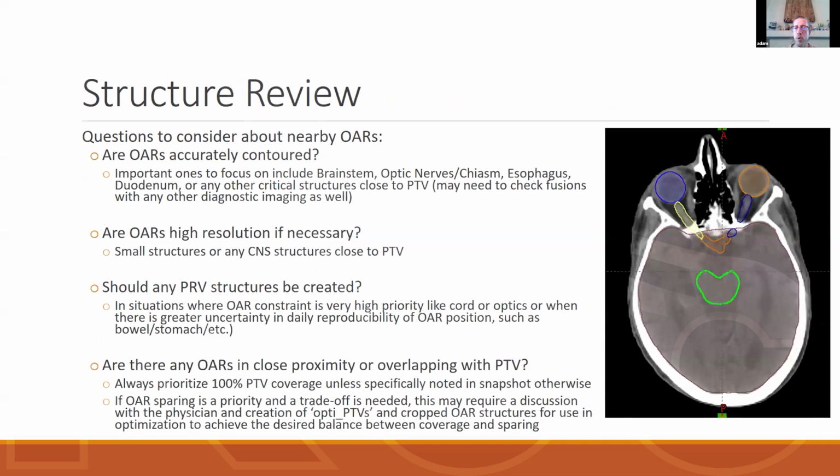And so something really important, some hospitals utilize it a lot, some not as much. But imaging, if you think about it, like Brendan said, it's what we use to actually contour, and the contours are what are used for planning. It's also what we use to treat the patient. And so looking at all of your imaging and seeing what's important in terms of organ at risk motion, movement, are there preferable phases? If there's a 4D, are the fusions accurate? Are the fusions appropriate, right? So you wouldn't want to fuse, say, something that's moving in a free breathing CT because you don't really know what phase it is in a free breathing CT. So these fusions and imaging, it's really important to really take time to consider it as a department.